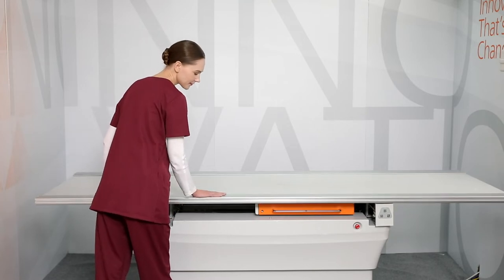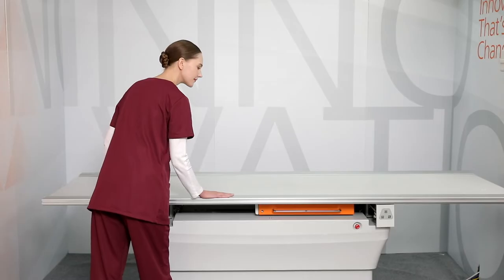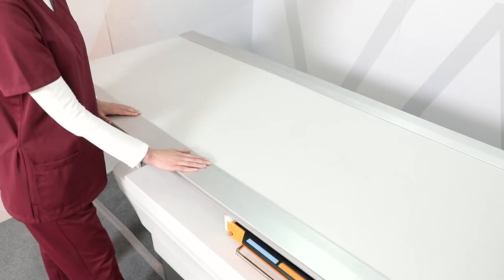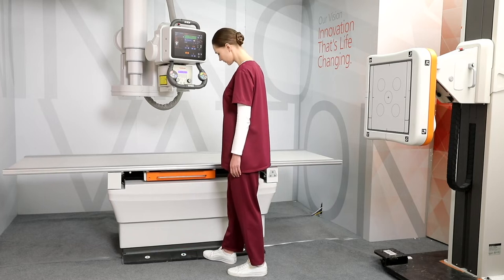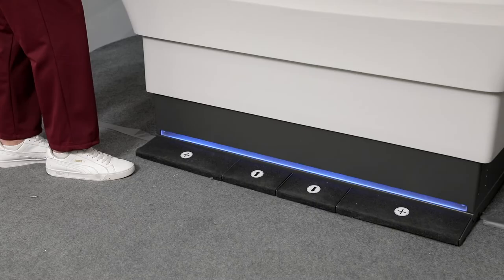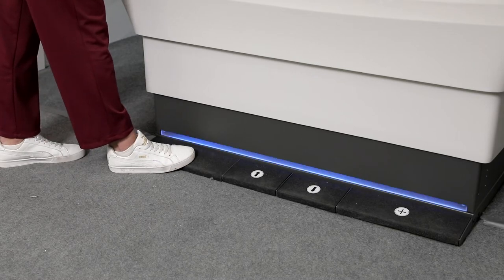The DRX Evolution Plus system uses an easy-positioning, low-profile table with a four-way float top. You can select from a standard table or a heavyweight table to support bariatric patients up to 320 kg. Double tap foot pedals provide additional safety when raising or lowering the table, while illumination provides ambient lighting for easier access. An additional set of pedals can be added to the back of the table for optimum access.